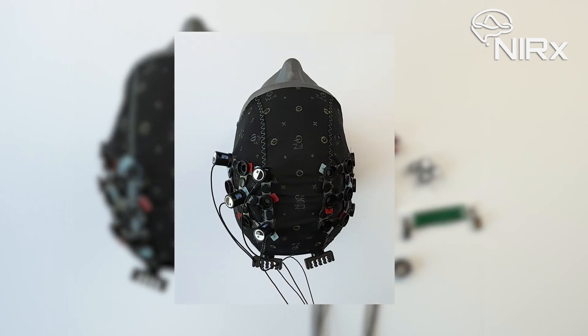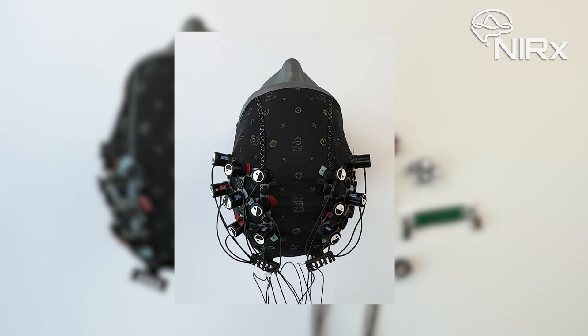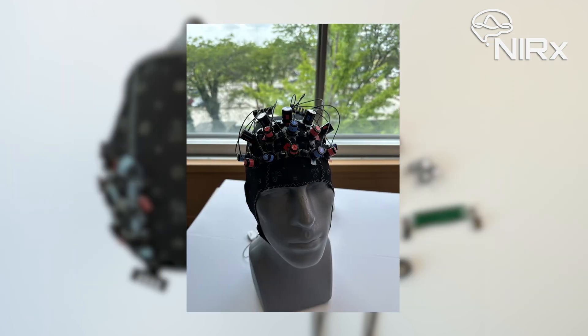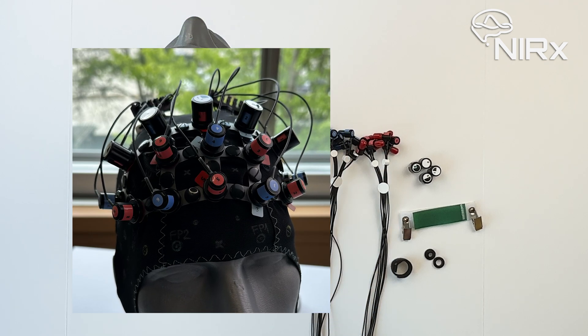Note that in this tutorial we will show you how to apply the optodes using spring tops. However, if you're working with a prefrontal montage or with a population with little to no hair, you might want to consider using AC rubber grommets instead.